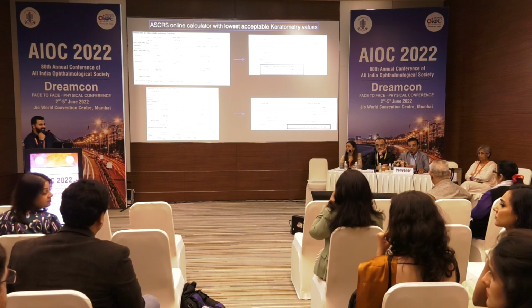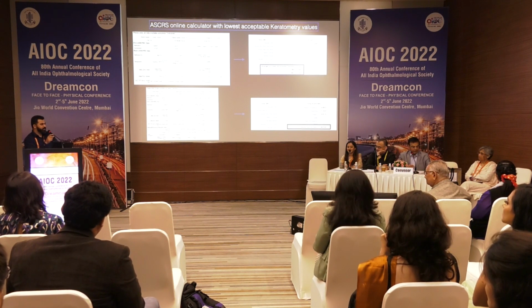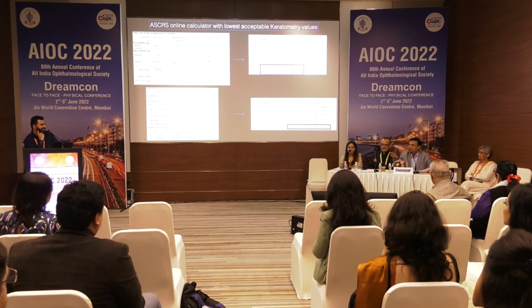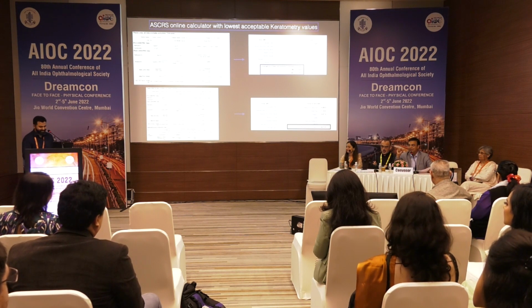There have been cases where I find a discrepancy between the Pentacam EKR map and the optical biometer, and I've usually found the Pentacam EKR map has given me very good results, but only for such eyes. You can't use it for virgin eyes, or you'll go horribly wrong. True, true. So that's a catch.